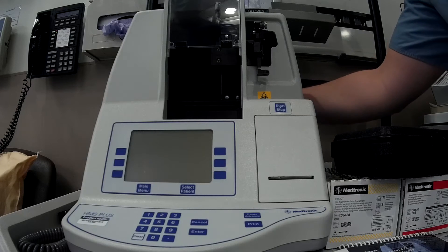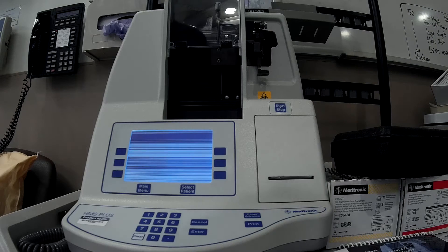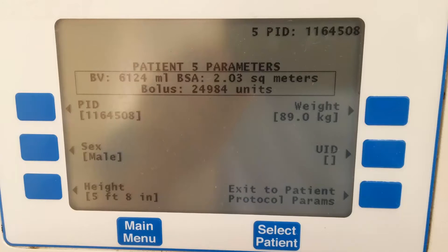To begin using the HMS Plus, turn on the power with the switch on the back of the machine and let it boot up. Upon initialization, the first thing you should do is enter some patient parameters. Start by entering the patient ID and then enter the patient's sex, height, and weight, as well as the prime volume of the circuit. These parameters are necessary for the HMS Plus to accurately calculate a heparin dose.